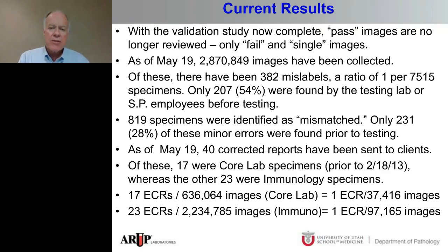When we moved that system to a different track, the specimens went to a different laboratory section that wasn't running their tests every day of the week. It's the immunology laboratory. Some of the testing is higher volume and is run constantly, but some of it is lower volume, and some of the tests are run twice a week or 3 times a week.